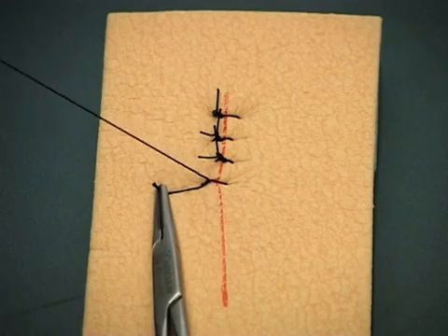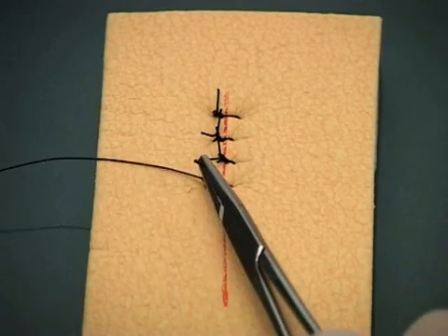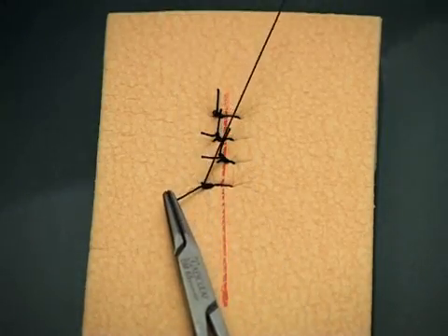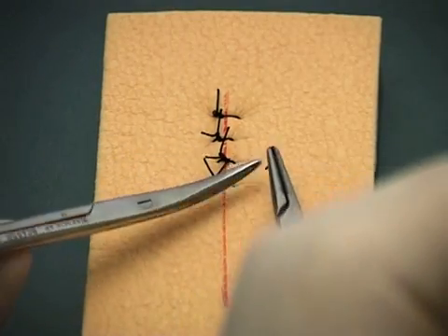The simple interrupted suture is the easiest to perform and can be used for most skin suturing. Should the wound become infected, a few sutures can be removed without disrupting the entire closure.